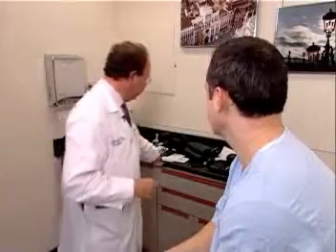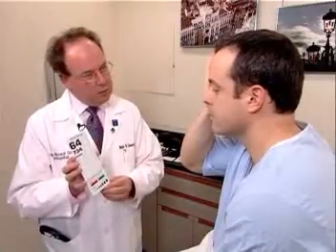Mr. Johnson, we're going to start with assessment of your vision. Visual acuity is determined by either a wall-mounted Snellen chart or, very commonly, a pocket Snellen chart, as I have here. Mr. Johnson, would you take your right palm and place it over your right eye? I'm going to hold this about 14 inches in front of Mr. Johnson's left eye. Could you read the smallest line possible? Okay, 2, 4, 8, 3, 7, 6, 1.